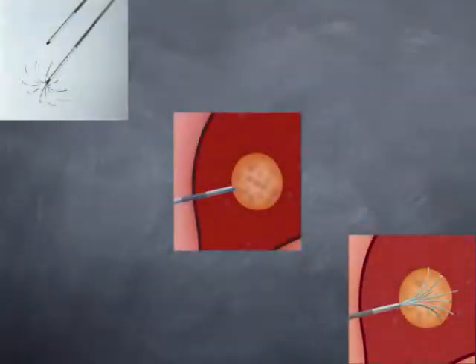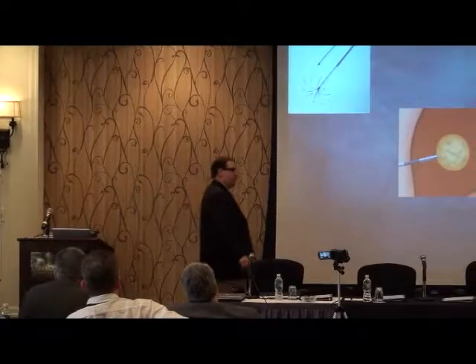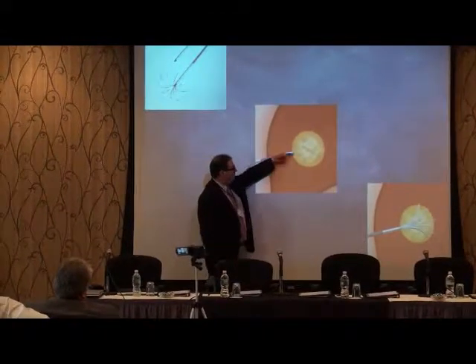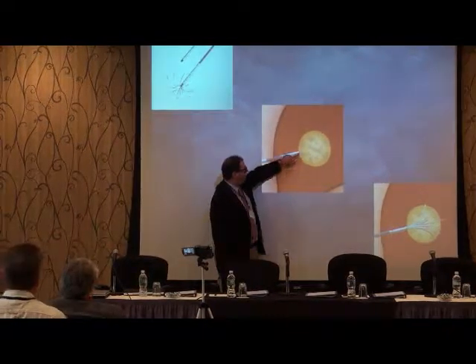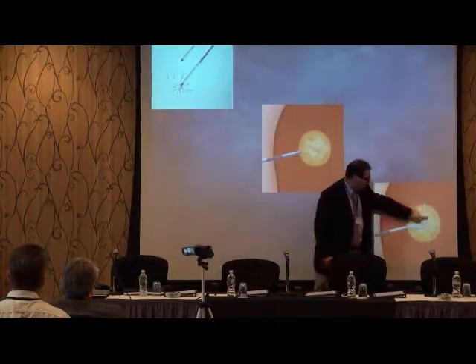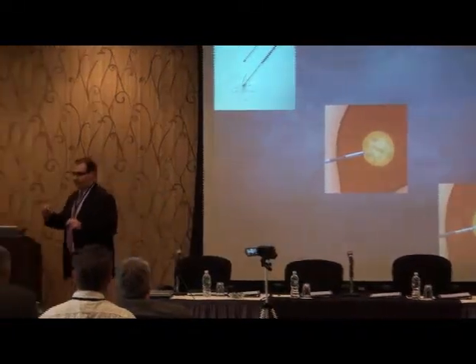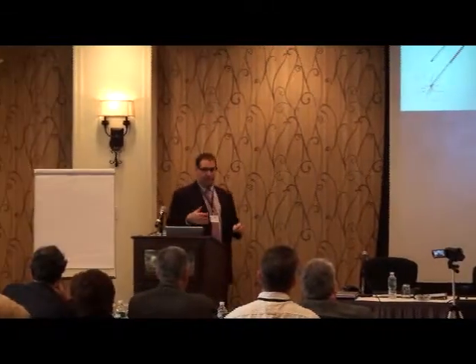And here's a schematic. That is the radiofrequency probe. The top image shows first the probe, and then these tines are extruded once we're at the edge and within the tumor. So we would then navigate with CAT scan or ultrasound. Just like we do with a biopsy, we just pass a needle directly into the tissue which we're targeting, and then once we get into the tissue, we deploy these tines, and each of these tines is connected and is delivering energy and is heating up the tumor and killing the tumor.